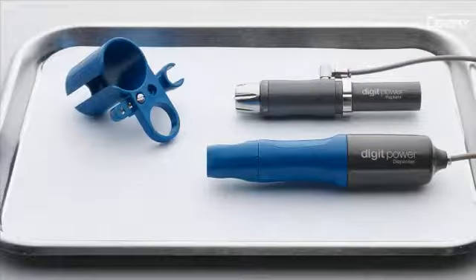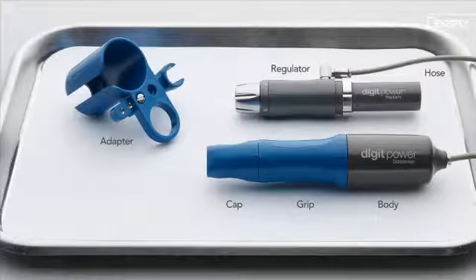The DigitPower Dispenser consists of a body, grip, cap, hose, adapter, and regulator with ISO threaded connector or quick connect coupler.